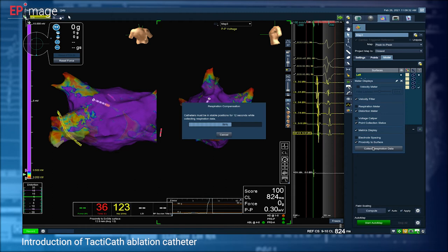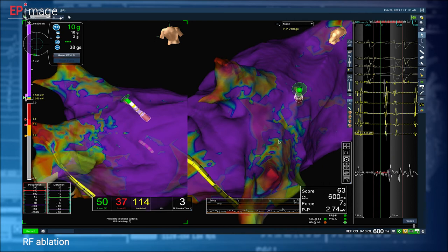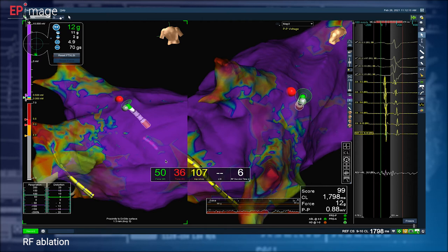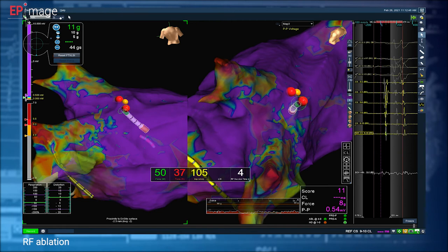So we've just finished mapping, the catheter has been changed, so now we have the TactiCath SE ablation catheter introduced, and we are starting with the first ablation point. Each of us has some kind of system, where to start and how to go, how to perform his ablation. I usually start with the posterior wall around the left pulmonary veins. What you see now is a real-time application with 50 watts.